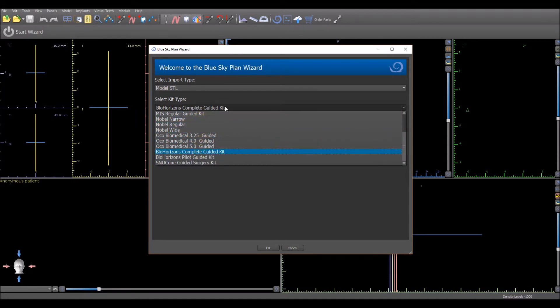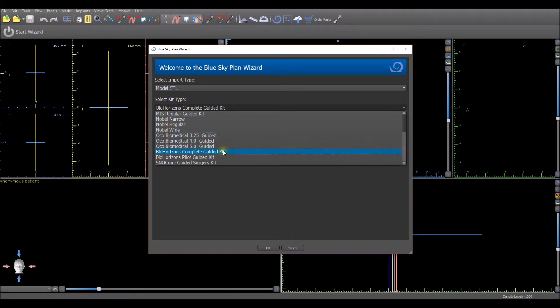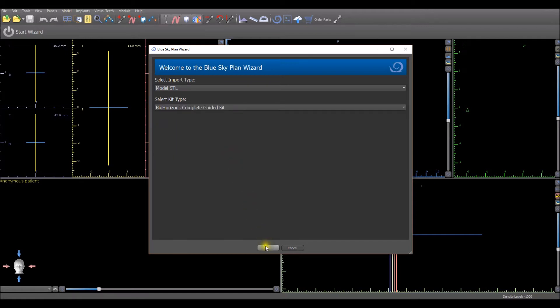For the purpose of this tutorial, we will select the BioHorizons Complete Guided Kit and then we will press the OK button.